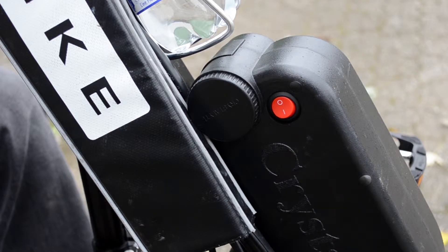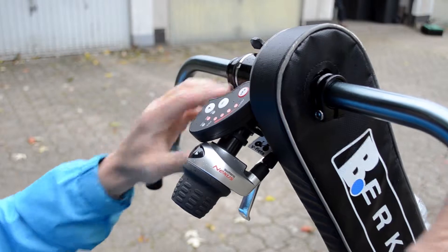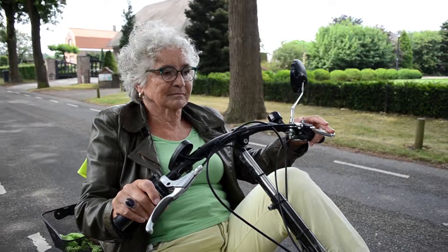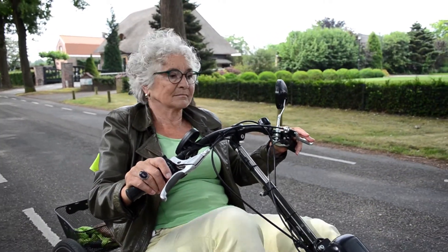The pedaling support of the Birkle Bike has a self-drive button. When this button is pressed, the bike will ride automatically at a low speed. This function is often used to get started, to climb a slope, or to get home without having to make any effort.